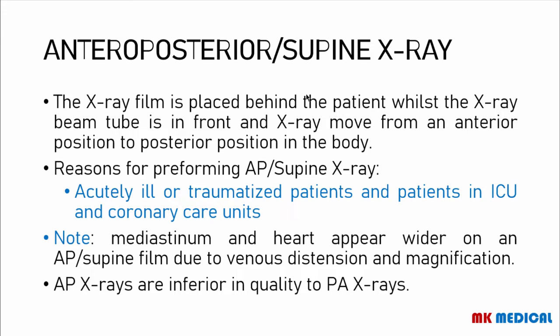So the reasons why we can order an AP, or anterior posterior supine X-ray, are, for example, in patients that are acutely ill, in patients that are traumatized or too sick to stand, in patients that are in ICU, even in patients that are in coronary care units. Then we can order an AP chest X-ray. So for bedridden patients, you can order an AP chest X-ray.